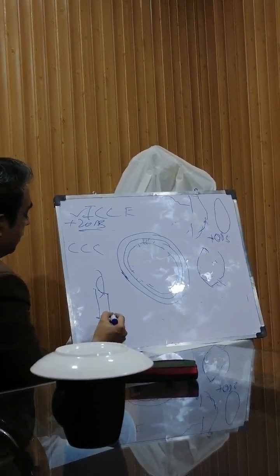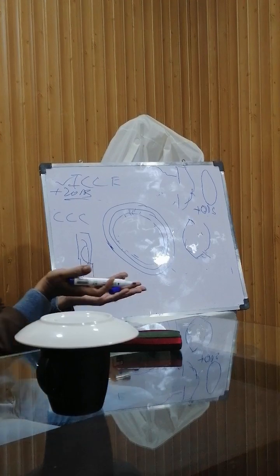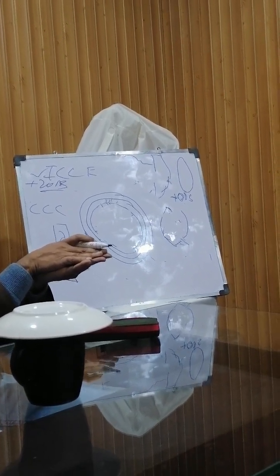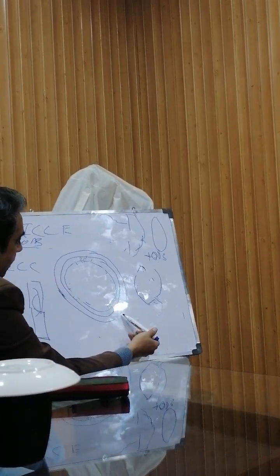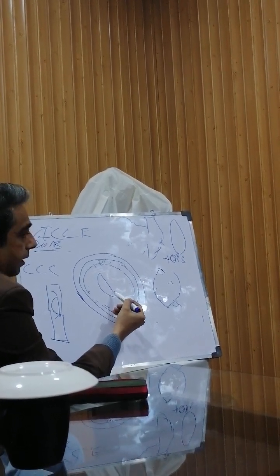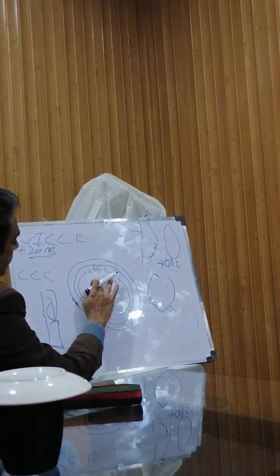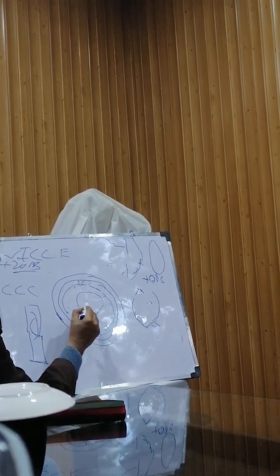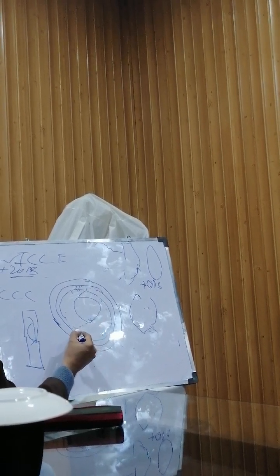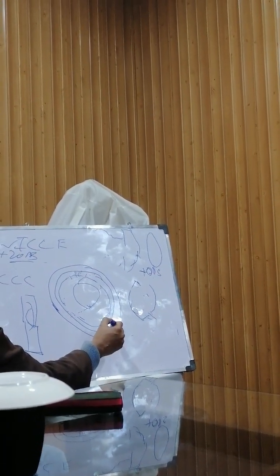This is just like an injection in which the lens is present. We inject that lens into the eye, and when it is foldable, it is almost 2.5 or 2.6 millimeter, even smaller than the incision. We pass that injector into the eye, the lens goes inside, and then when you leave it, it automatically unfolds. The haptic goes under the capsule and the lens, and the second haptic goes here. And the incision is so small that there is no need of any suture to be applied.